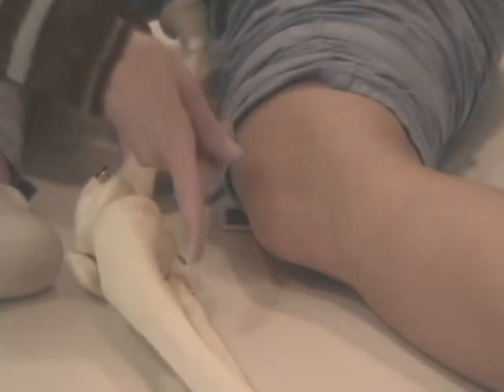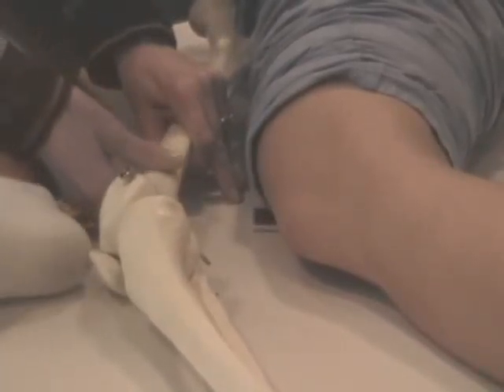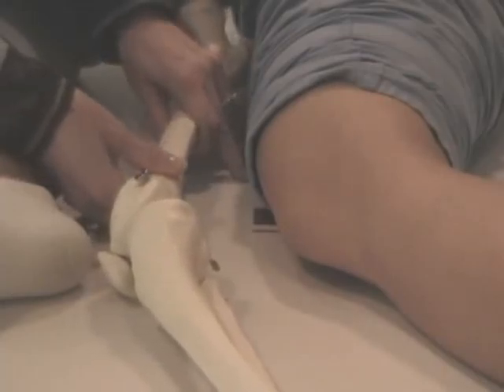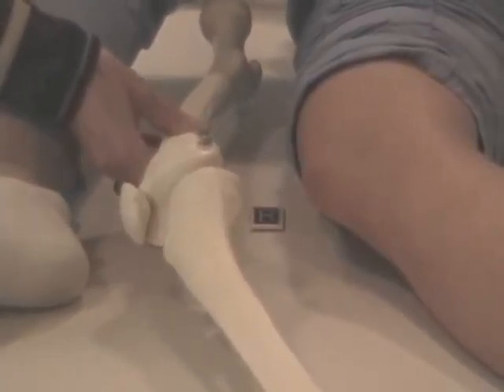If you see too much space between the fib and the tib, and you see the adductor tubercle lying anterior, you know that you have taken this X-ray with the knee too close to the table. And to fix that positioning, you need to change your perception and elevate the knee away from the table more.